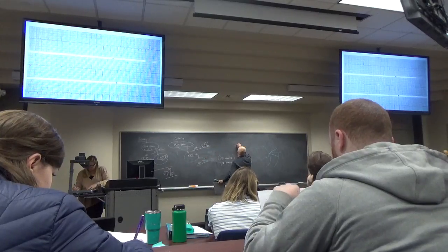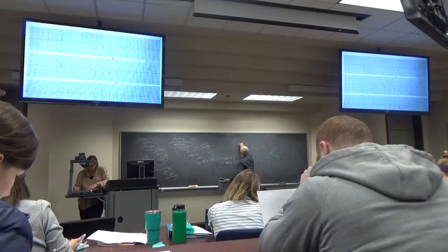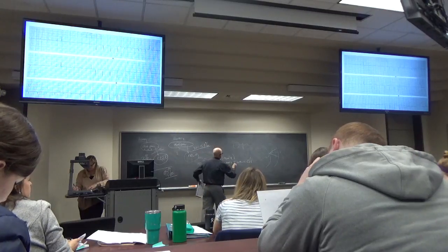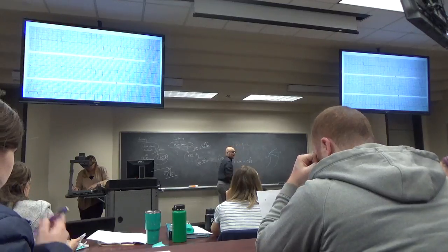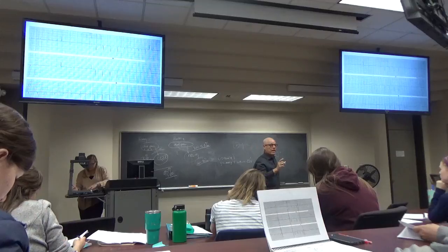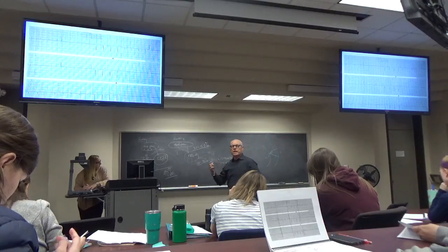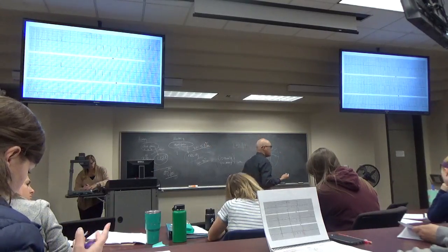A biphasic P wave in lead V1 means left atrial abnormality. Right, that's what a biphasic P wave is. If this terminal portion is 0.04 wide and 0.04 deep, you get three points towards LVH because that means left atrial enlargement. Okay, electrocardiographic criteria for left atrial enlargement.